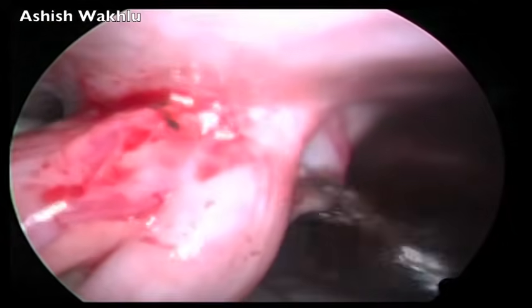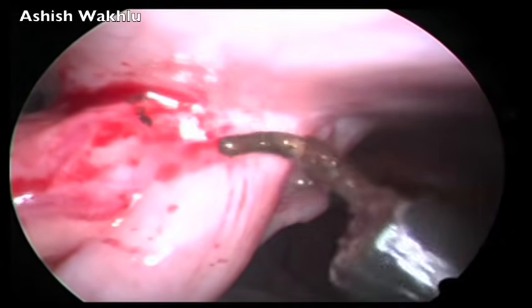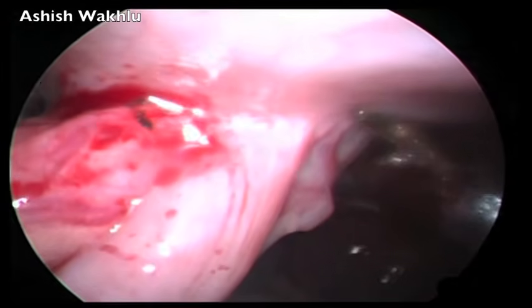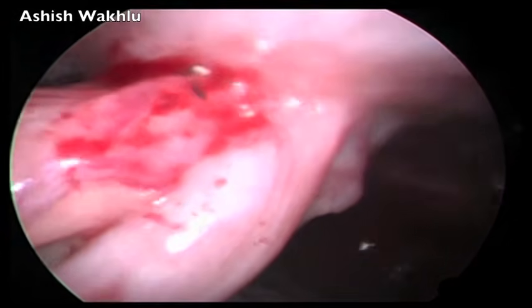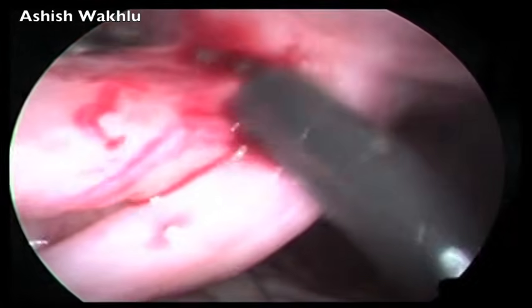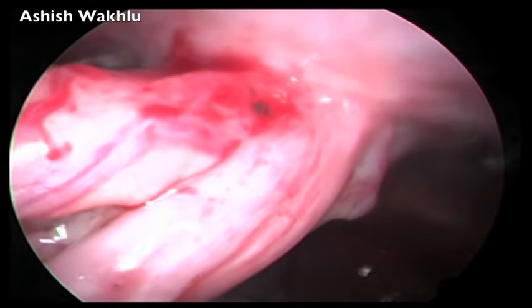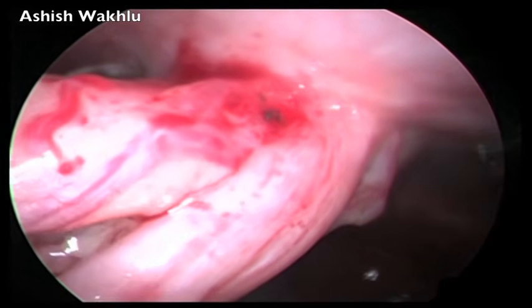Having divided the fistula, we now turned to mobilize the colostomy because, as we saw earlier, the sigmoid was actually going across the abdomen like a bowstring, and without taking down the colostomy, it was not going to be possible to get the rectum out to the skin.